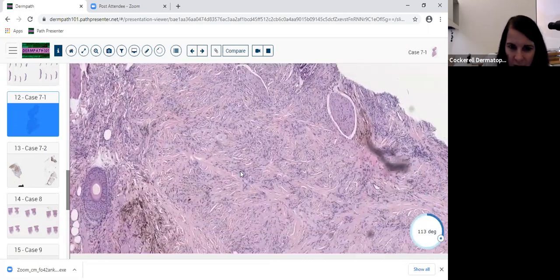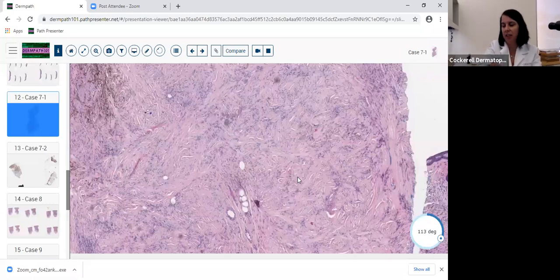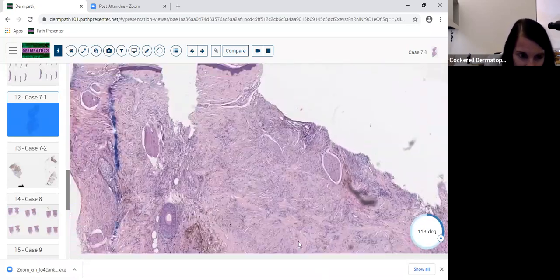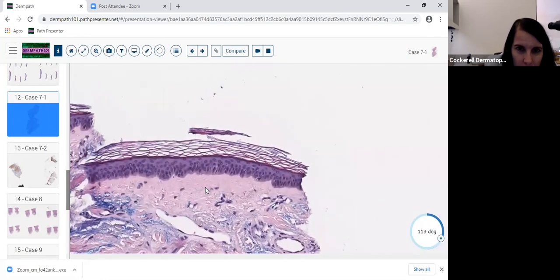And right away, when you're thinking about a blue nevus and it's this huge and it's involving the panniculus, on your test, you will get a blue nevus. They're going to put it on your test multiple times in multiple questions, both without slides and with slides. They love blue nevus because they want to show you, well, there can be a mitosis here and there, but if you start seeing a lot of mitoses and a lot of atypia and high NC ratios and necrosis, and you start to see an intraepidermal component, you need to steer away from blue nevus and start steering toward a melanoma or a malignant blue nevus, which I hate to use that term. But again, look at your epidermal component.